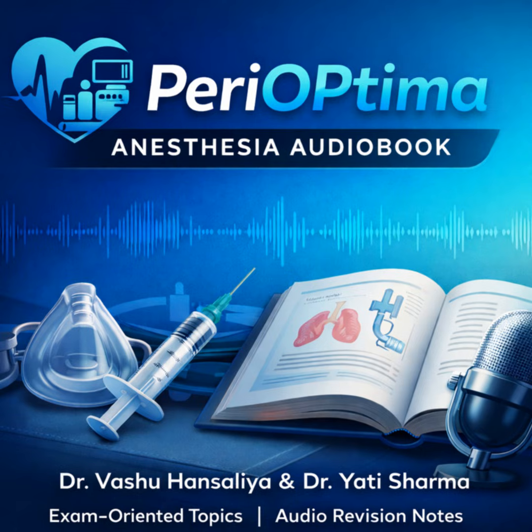What about success rate in difficult airways? DL is very successful in normal airways, but that success drops off a cliff with Cormack-Lehane grades 3 and 4. VL demonstrates a much better glottic view and therefore a higher success rate in those anticipated difficult airways.